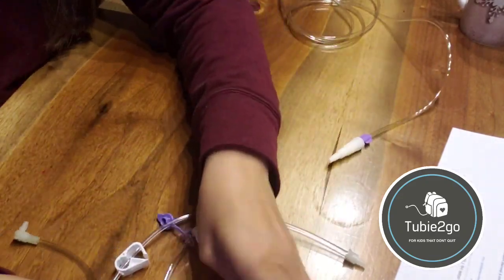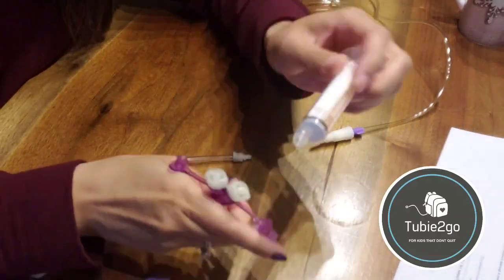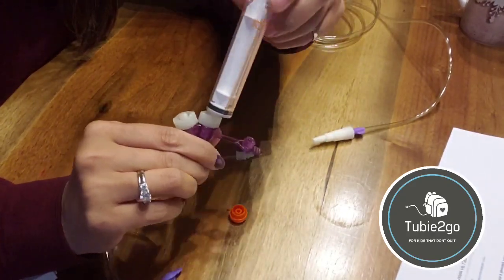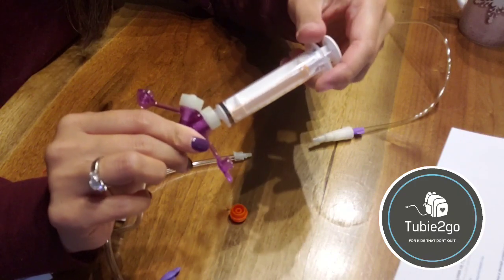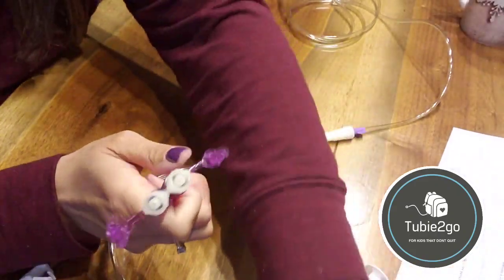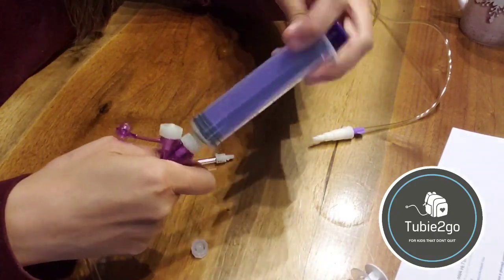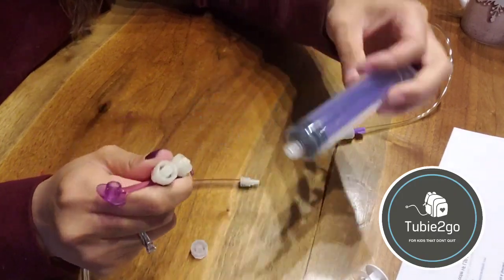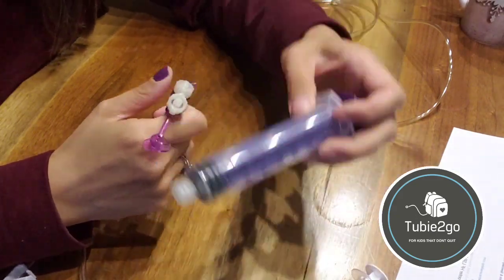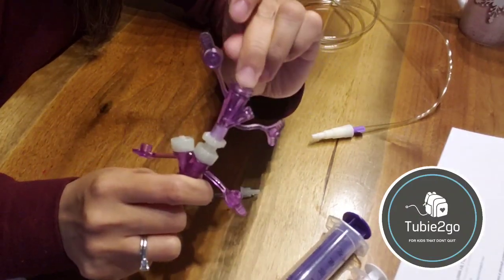And it also means if you're going to have these ENFit extension sets, that you're going to need ENFit compatible syringes as well, rather than using your typical oral syringes. These ones are going to have to screw in so that, again, you don't accidentally push meds that are going to pop out of the normal ports. So there's all sorts of different sized ENFit syringes that would be compatible with these ENFit extension sets. And that doesn't necessarily mean that you need to have ENFit syringes, but there are options where there are adapters as well, where you can put onto the ENFit end.